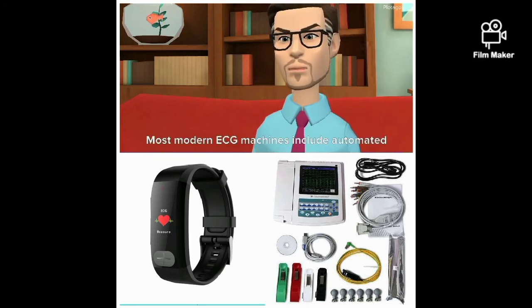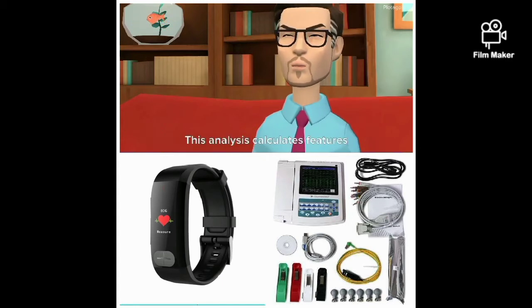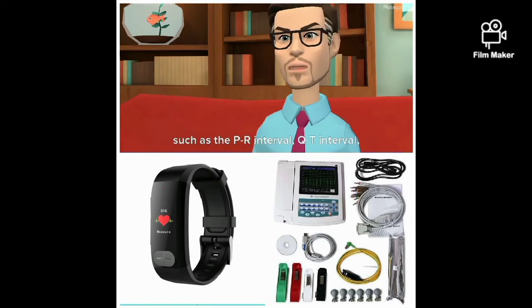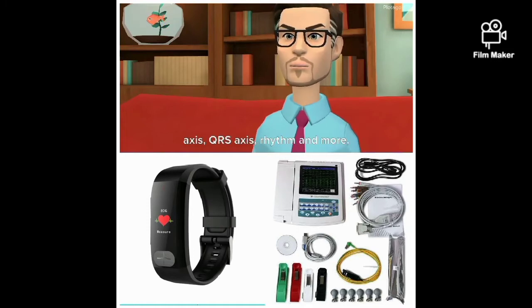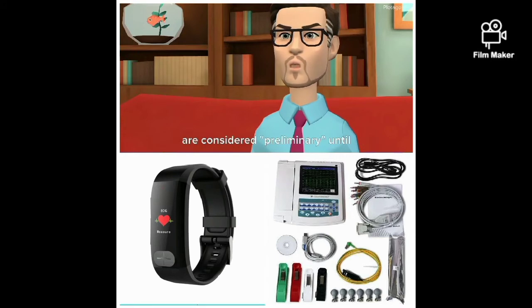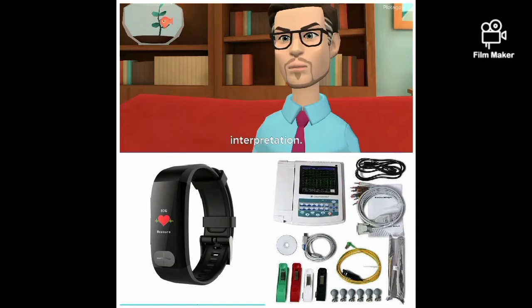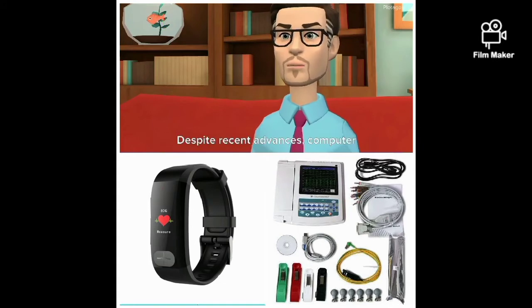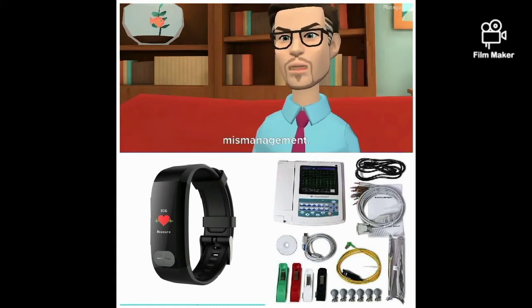Most modern ECG machines include automated interpretation algorithms. This analysis calculates features such as the PR interval, QT interval, corrected QT, QTc interval, PR axis, QRS axis, rhythm and more. The results from these automated algorithms are considered preliminary until verified and/or modified by expert interpretation. Despite recent advances, computer misinterpretation remains a significant problem and can result in clinical mismanagement.